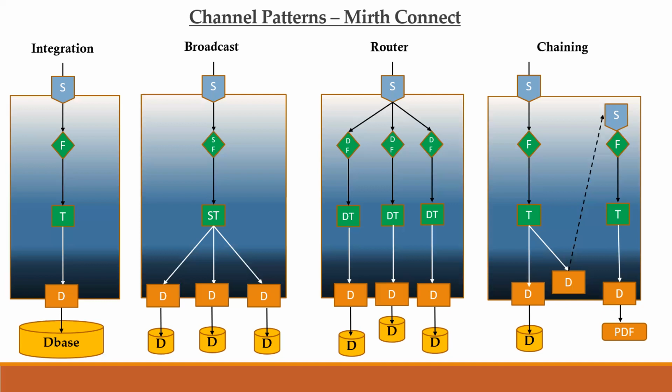But in the beginning, if you are very new to Mirth Connect, it may take some time to reach a point where you can design your own channel. So who does this? Mainly the architects and technical leads who are already well versed with the product will design these interface patterns and say that this is the interface pattern we are going to use for our project. As they have broader knowledge of integration aspects and have been working on Mirth Connect already, they will give you a better and clearer picture of how to build a certain channel. So if you're a beginner, don't worry, that's not on your plate, but slowly, as you develop your channels, you'll get a fair idea.